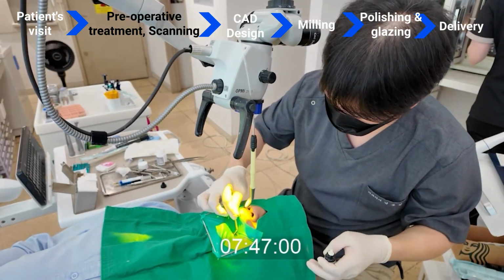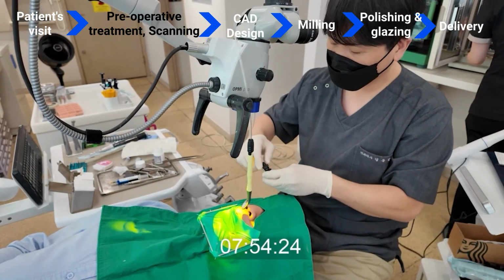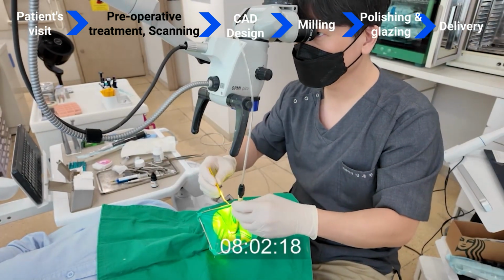We rinse, apply the bonding agent, spread it thinly with air, and cure it with light before layering on the resin.